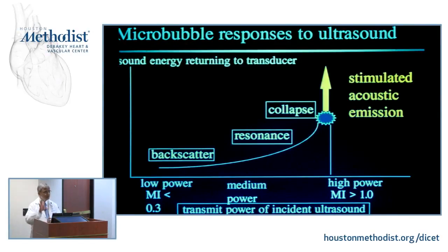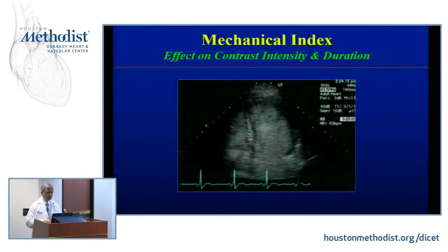And it's going to have a certain pattern different from what you've seen with the attenuation. So if I can dial down my mechanical index gradually, I'm going to destroy less, I'm going to preserve them more. I'm not going to see as much before I inject contrast. The image is going to look faint because it doesn't have much reflectance, but certainly it will enhance the ultrasound and will destroy much less. Okay? So that's, in general, what we're talking about.